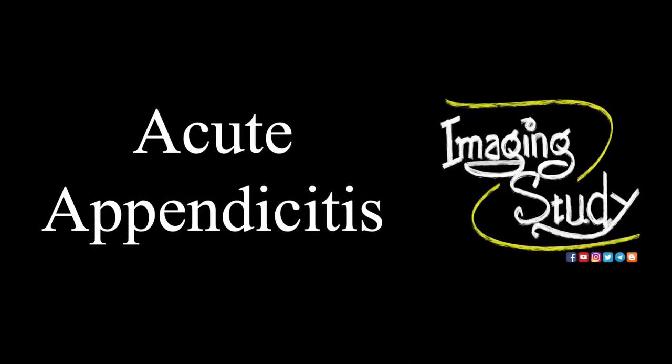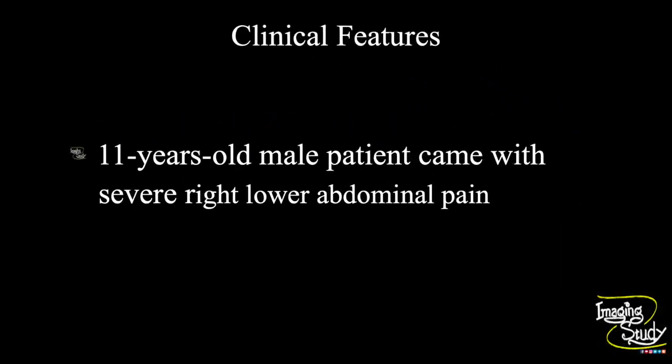Today we are going to see a case of acute appendicitis. An 11-year-old male patient came with severe right lower abdominal pain. Let's see what we have got on ultrasound.